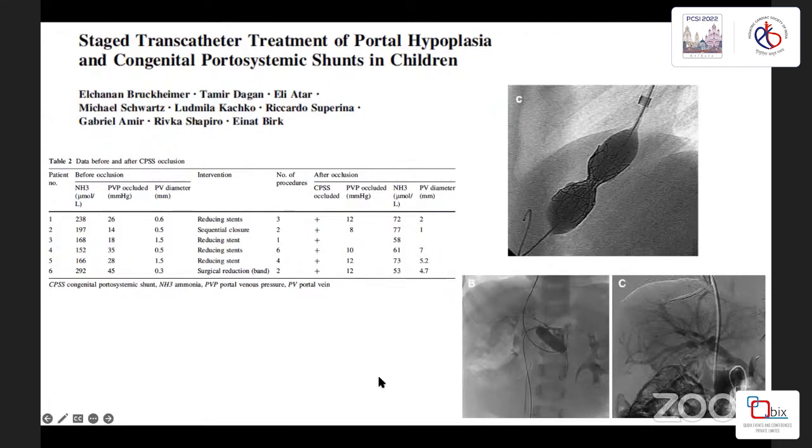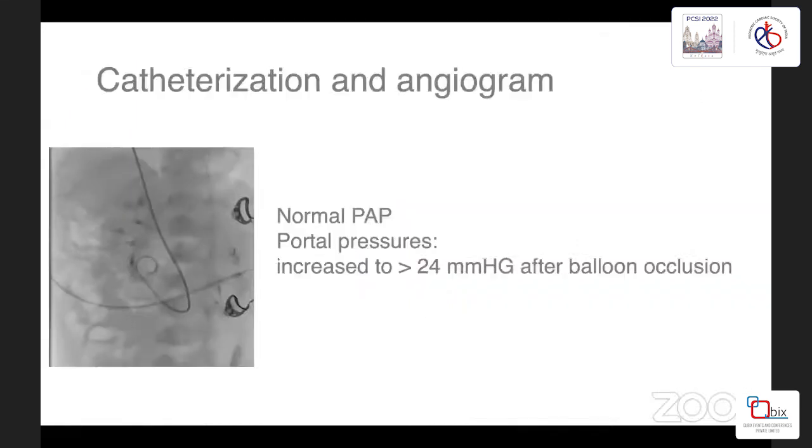So we thought we'll follow some of this, but I found this is technically very difficult: to suture the stent after inflating the balloon in vitro and then taking the stent is difficult. That's the reason we adopted a different method using the two stents technique. So what we did was a cardiac catheterization after balloon occlusion, which increased the pressure.